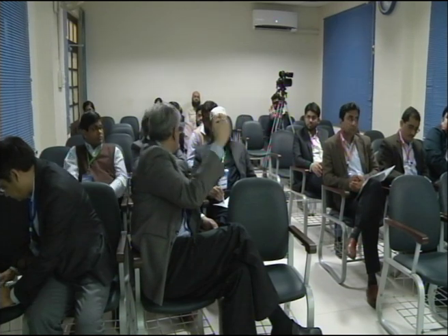That's the requirement. That's the BMG requirement. So if your centers are doing 500 ERCPs but are successful in 60%, that's not good. You shouldn't be doing it. Then I'm sorry, you need to go back and think and know what you're doing.